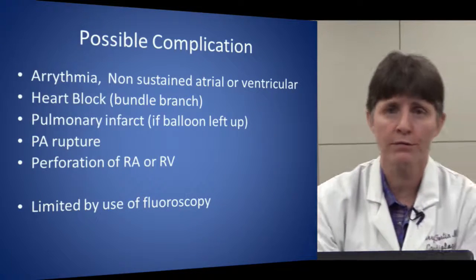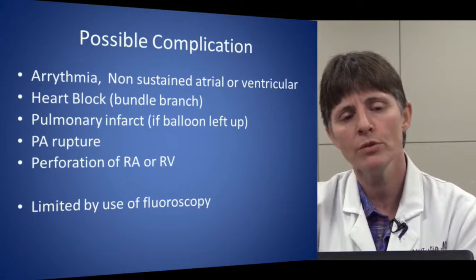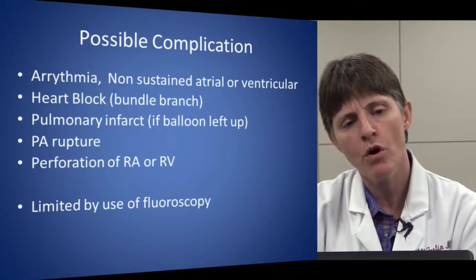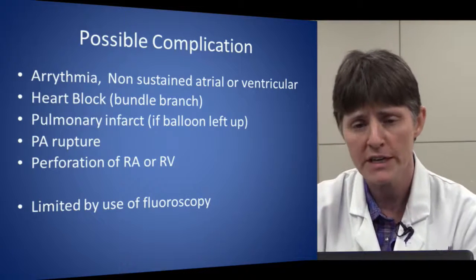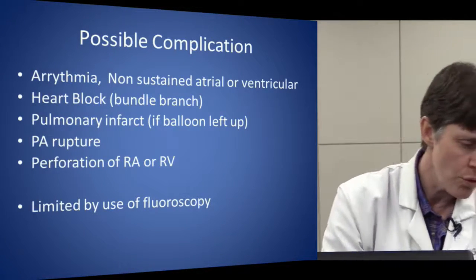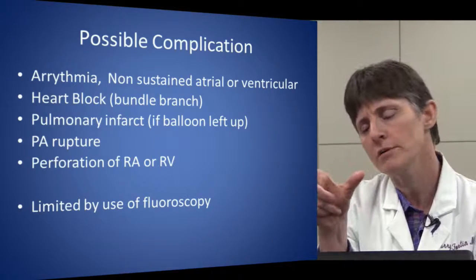Complications of putting in a Swan or doing a right heart cath. So as we float the Swan through the chambers, if we're running into the chamber walls, we can cause arrhythmias. So we get little runs of SVT or little runs of ventricular tachycardia. They're usually non-sustained.